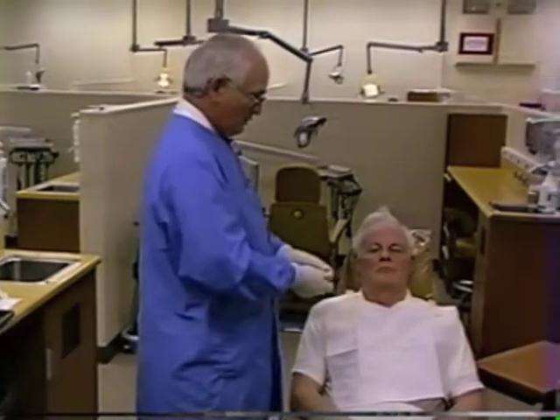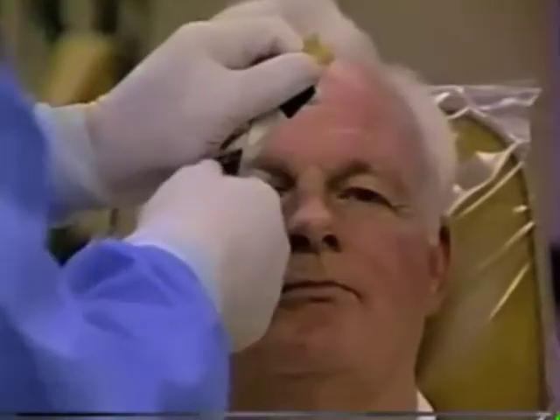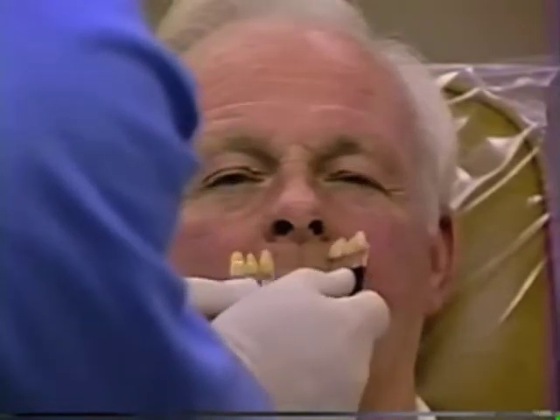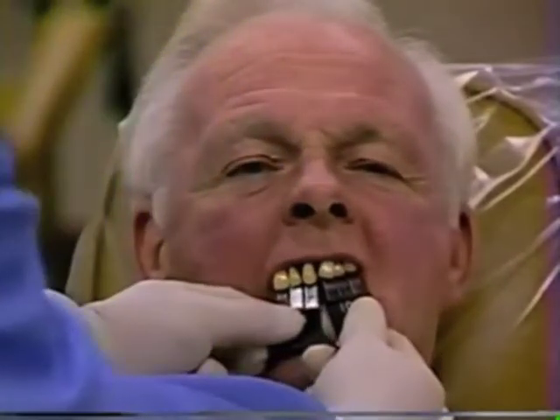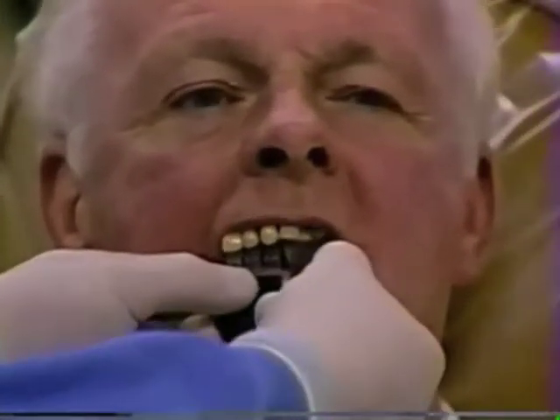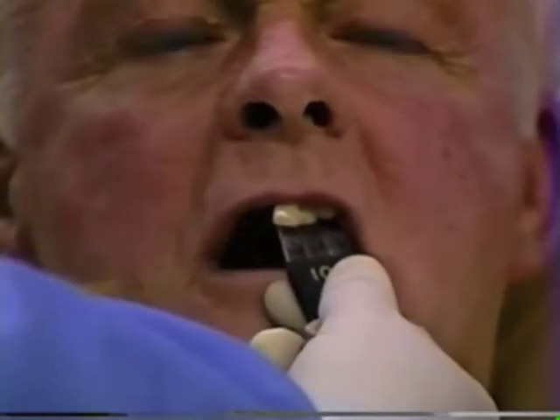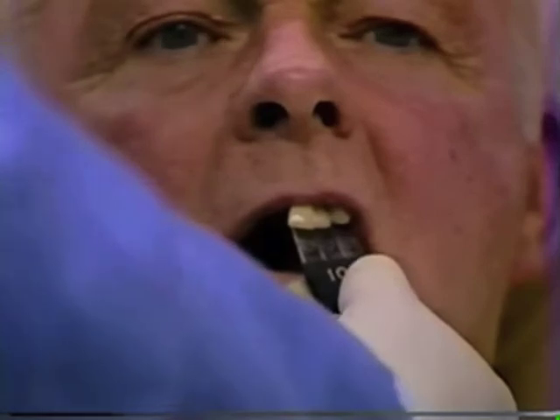Let's start with one from the top row and one from the bottom row, trying to determine which we dislike. Holding them up and asking the patient to open — obviously the tooth on his right is much too yellow and does not fit well with his complexion. We're going to get rid of that one, which happened to be shade 114, a fairly dark color.